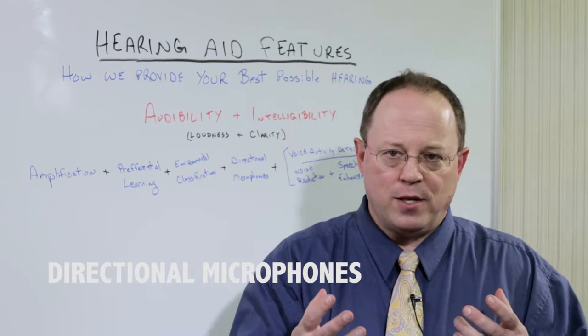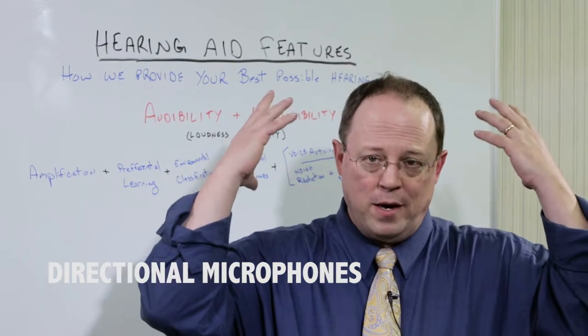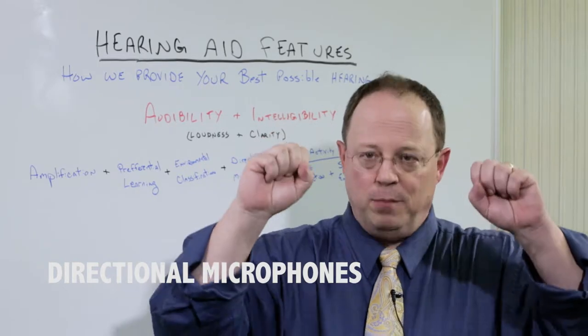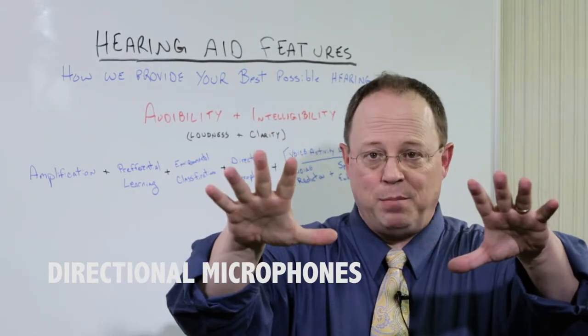The most basic directional microphones — when you go into a noisy environment, the rear microphones attenuate. They don't cut all the way off, but they cut way down as far as how much they're picking up. The forward microphone stays on, so who you're talking to is amplified.